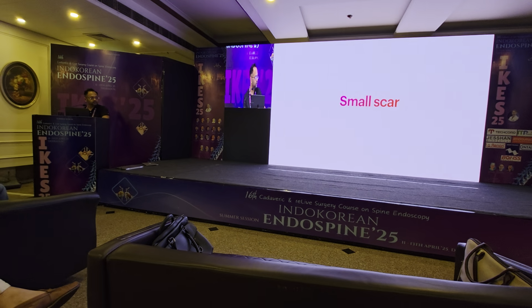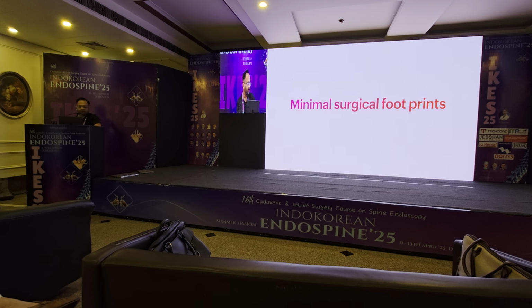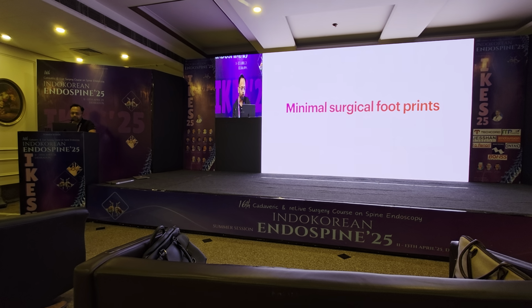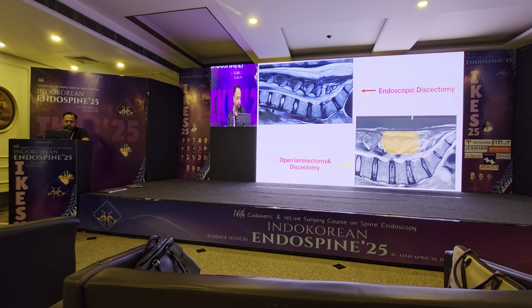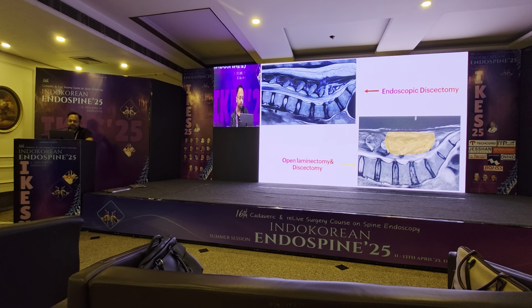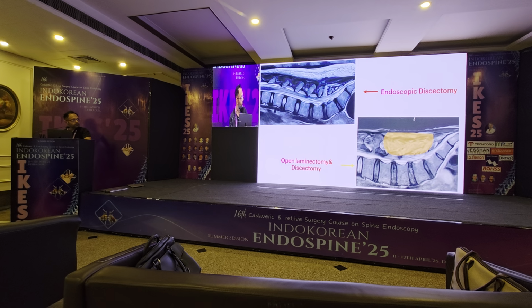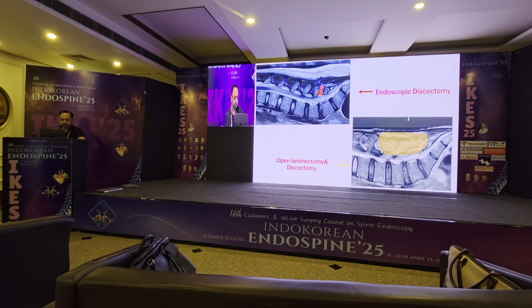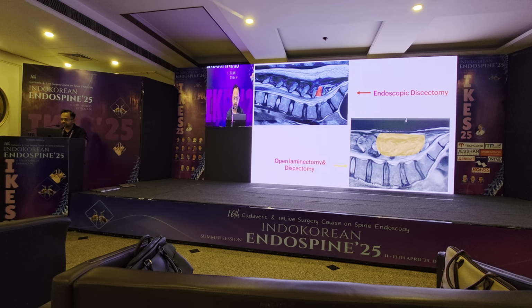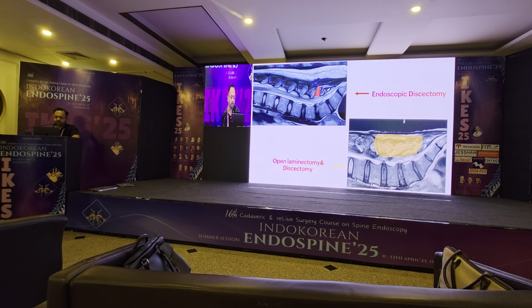And of course, a small scar. And definitely minimal surgical footprint. This is the post-op MRI of a patient who has undergone L4, L5 discectomy. It's a normal laminectomy scar. You can see it's just minimal. You can see there is not much destruction of the facets or lamina. The multifidus muscle is thick and fine.